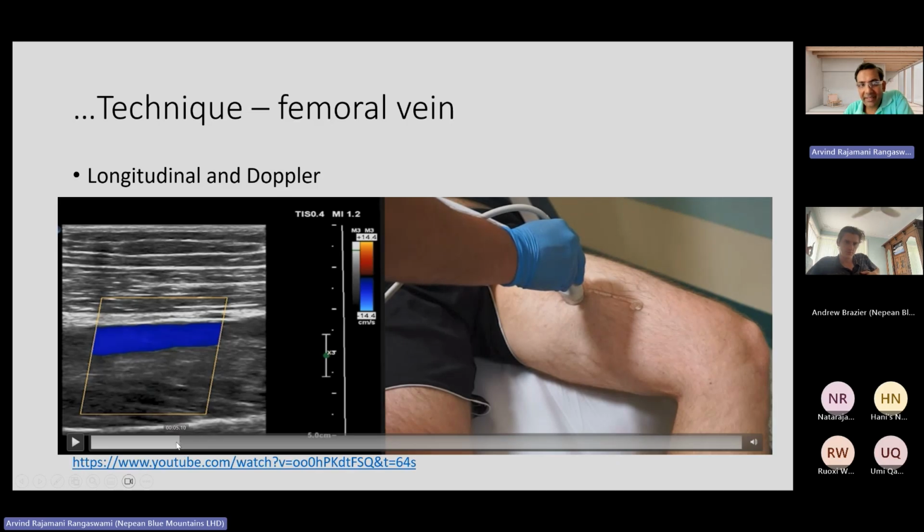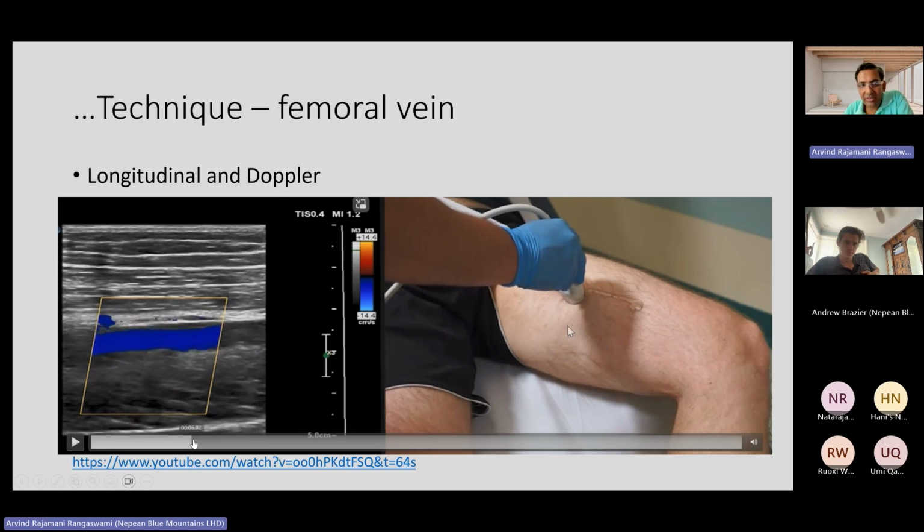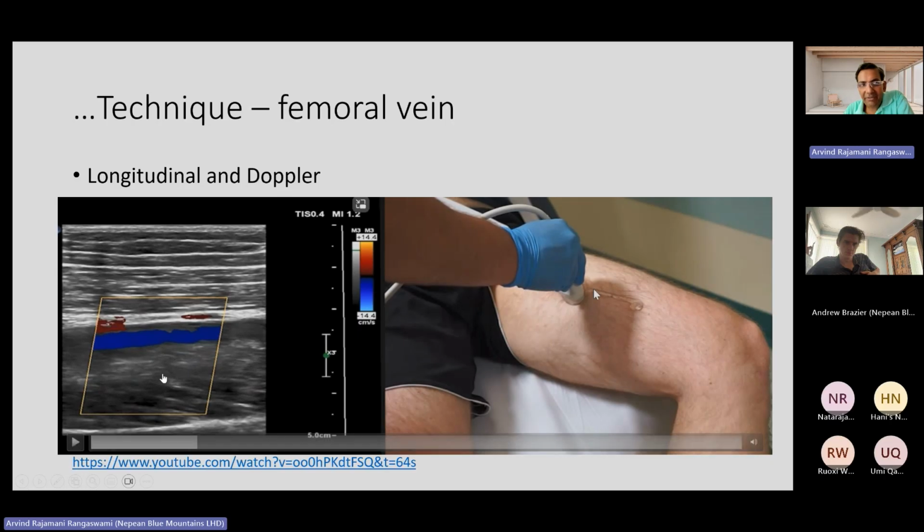You have a very nice, beautiful filling throughout the vein here. And if you're choosing the vascular ultrasound setting, the shape of this color box will be a rhomboid rather than a square. What this says is the machine is applying angle correction so that even if you are perpendicular to the vein, you can still have flow.